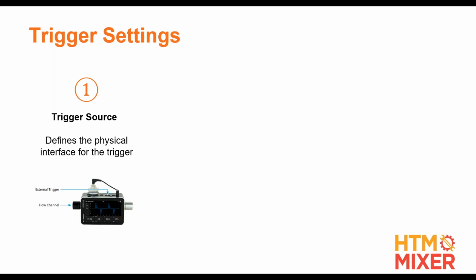Trigger source you're using. We can use pressure, we can use flow. In some cases, we have a digital trigger signal coming from the ventilator. Right now, we'll just talk more about the pressure and flow, because digital just tells it straight out, I'm in inspiration, I'm in exhalation. It's a TTL signal that comes off some ventilators.